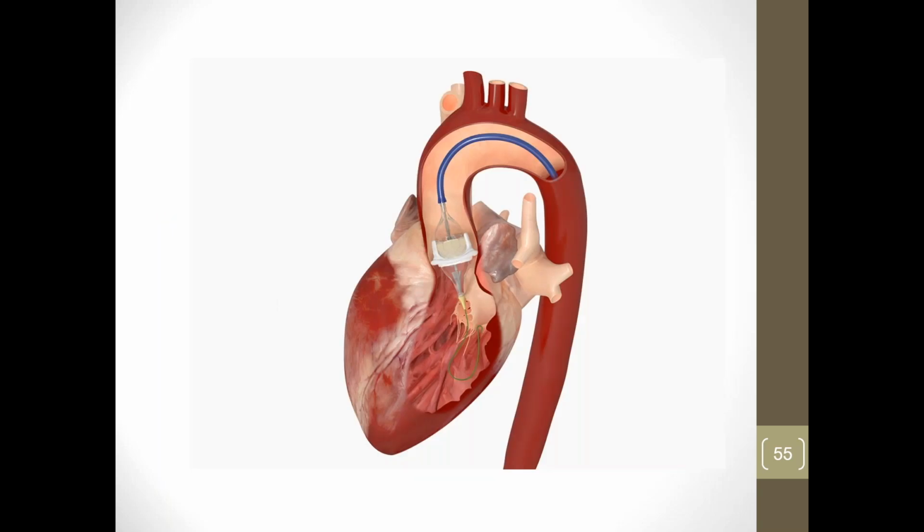And what they do is they go up through the femoral artery, go up into the aorta, and they can then replace the aortic valve without having to cut the patient open. So it's all done intravascularly, change out the valve, and without any serious surgical issues.